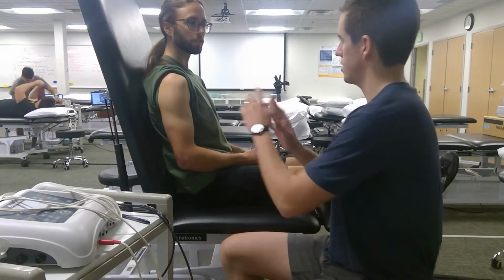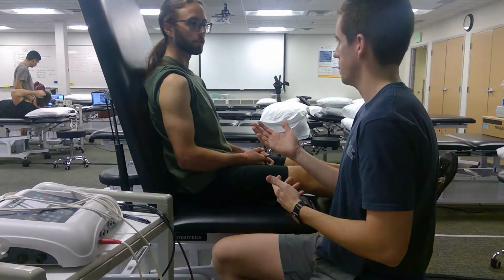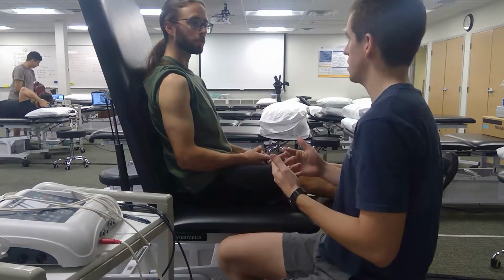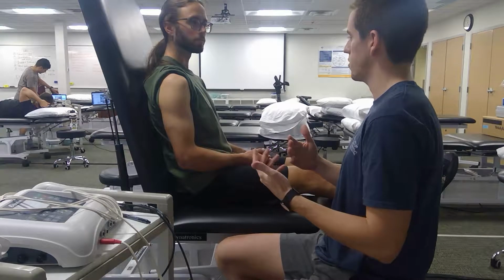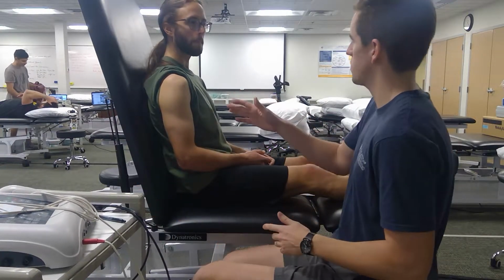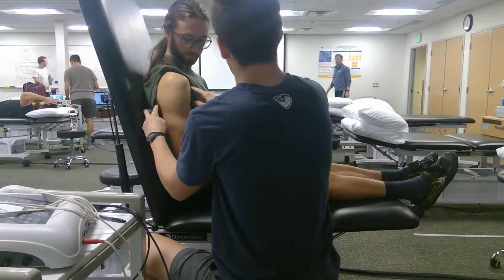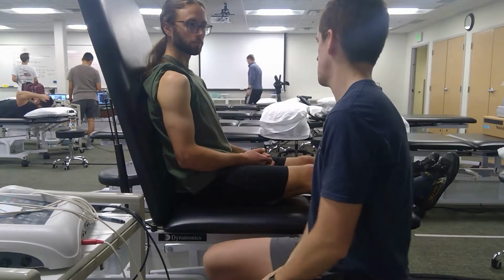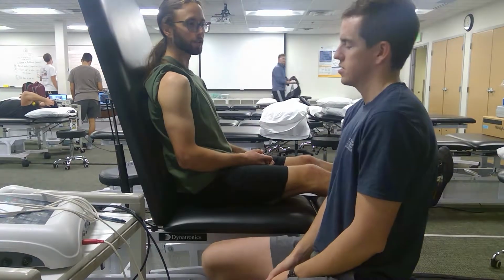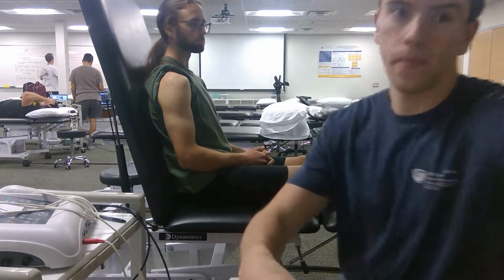Okay, in order to do so, I'm going to need to place my hands and some probes on that shoulder. Are you comfortable with that? Okay, the treatment's going to last about 20 minutes. You shouldn't feel any pain, some light tingling, and if you do, I'm going to be right here, and we can change the parameters of the treatment. Do you care if I inspect the skin on your shoulder just to make sure everything's intact? You haven't had any surgeries here, have you? And can I ask, do you have a pacemaker that I need to be concerned about where we are sending electrical stimulation through the shoulder? No. Okay, sounds good. So let's go ahead and set up the parameters here, and then we'll get going.